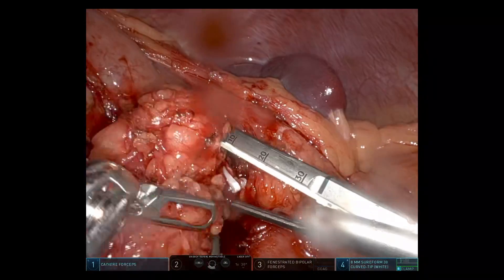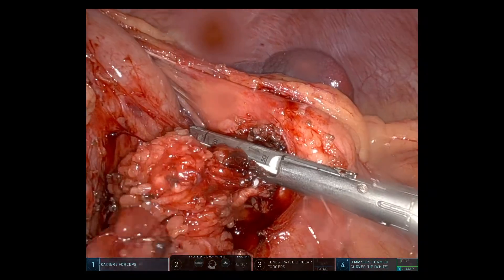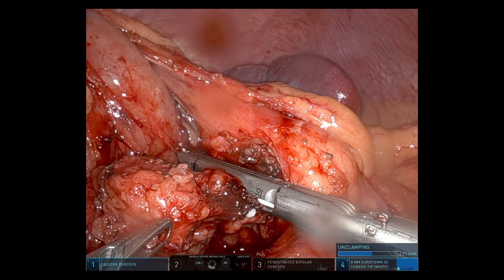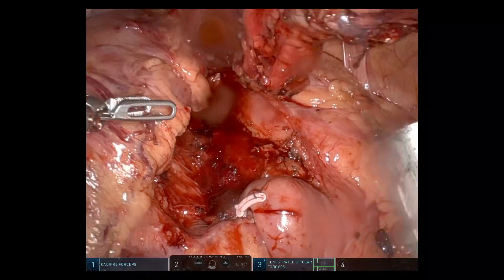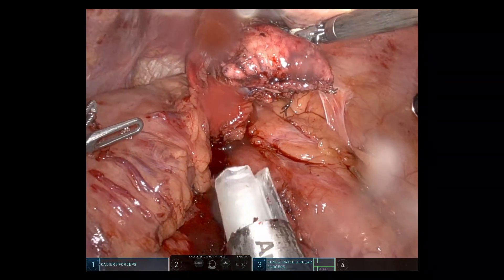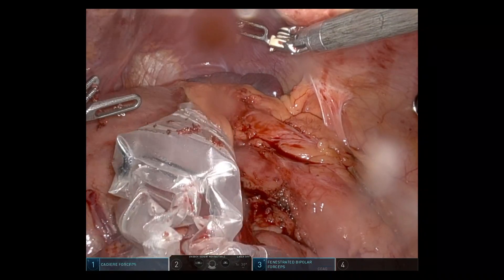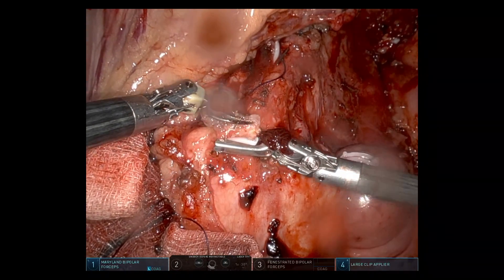The spleen looked okay — a bit ischaemic in the middle portion — but I didn't divide the short gastrics or drop the splenic flexure, so the upper and lower poles were reasonable. The specimen was placed in an Endocatch bag. Haemostasis was fine; I used a couple of FloSeal, one in the splenic hilum and one at the cut edge of the pancreas.